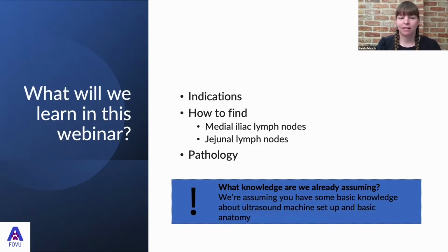So what will we learn in this webinar? We're going to look at the indications for scanning the lymph nodes and how to find the lymph nodes. We're going to focus in on specifically the medial iliac lymph nodes and the jejunal lymph nodes. That's because the medial iliac lymph nodes have great landmarks, so that makes them easier to find than other lymph nodes. And the jejunal lymph nodes are the largest lymph nodes in the abdomen, so that also makes them a bit easier to find. But these are not easy organs to start with in ultrasonography. So we are assuming a bit of knowledge already, obviously some basic knowledge about ultrasound machine setup and some basic anatomy. And finally, we'll move on to some pathology and some cases.